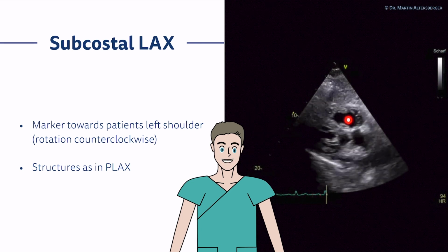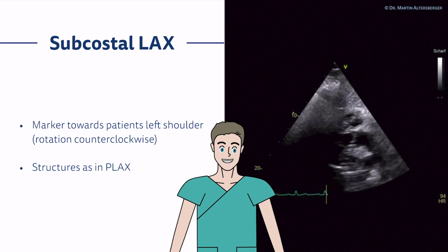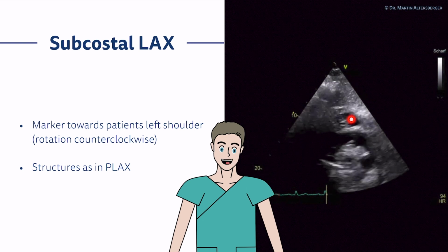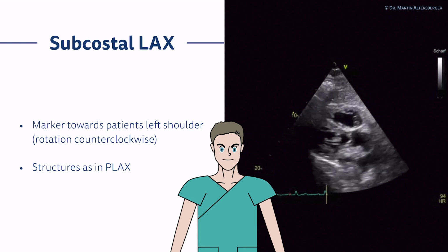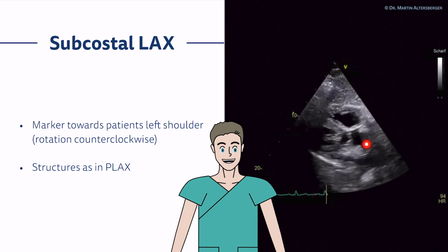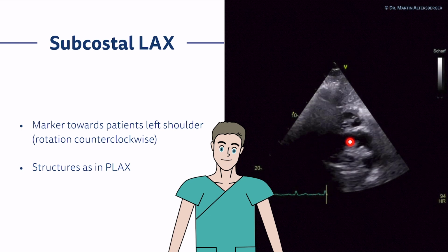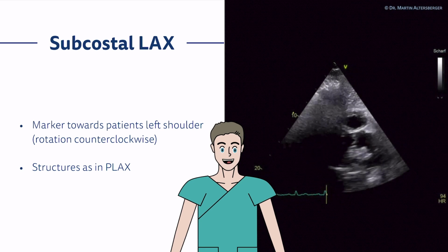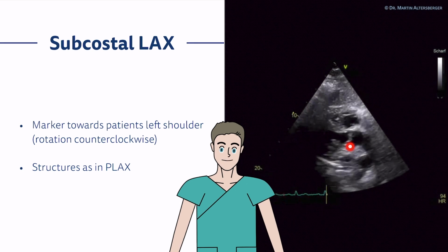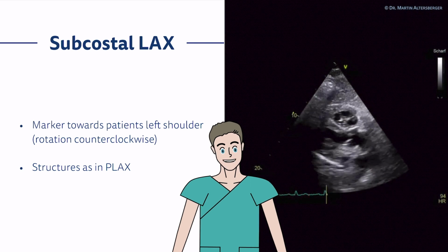In this case, you see the tricuspid valve, again here in this view, you see all the three cusps. So it's still a little bit off axis, but it's a splendid view of the tricuspid valve. The right ventricle, the left ventricle, here you see parts of the mitral valve, and the ascending aorta you can visualize here, the aortic root and of course the aortic valve opening quite nicely in this case. So already here you can see that there is definitely no aortic stenosis present.